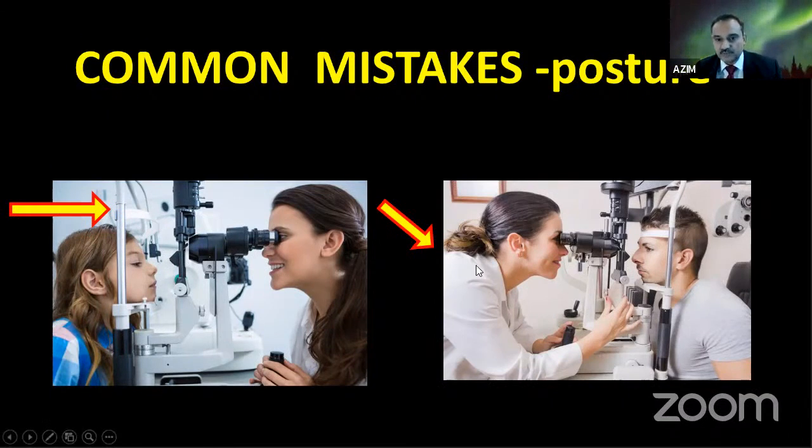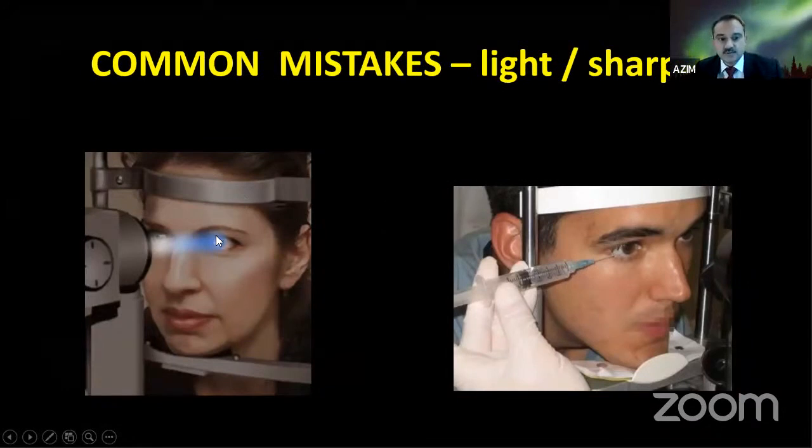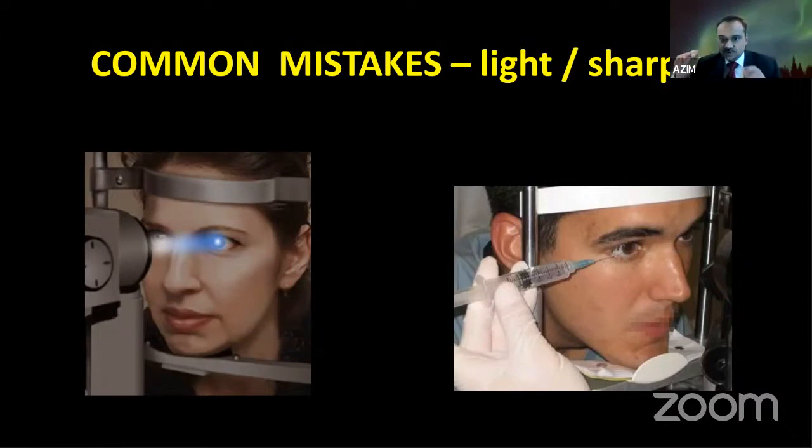Remember, you don't slouch back. If you don't want to go home with a back pain, don't do this. If your chair is not good, don't challenge yourself. Make yourself comfortable. Never do this to the patient. Don't keep the light full. I told you, always keep the rheostat low, switch it on with the beam away, then you bring it in. So the patient will be confident. Otherwise, the patient will be scared that you're going to hurt them.